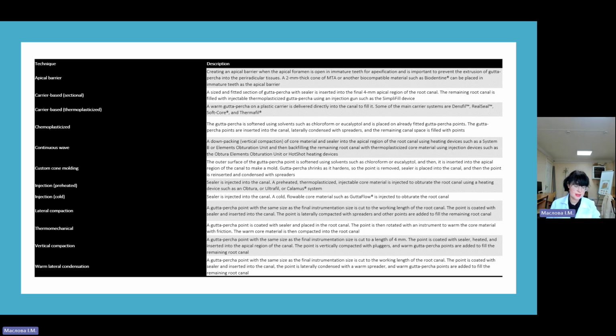Being made of 99% silver, they were initially thought to offer valuable antimicrobial properties. But in fact, the corrosion products were toxic and could reach the periapical tissues and compound the problems caused by silver dissolution. Silver points are thus no longer recommended as a core root filling material.